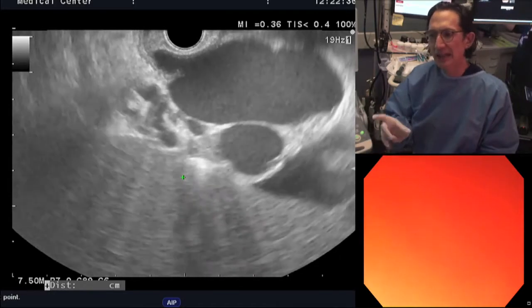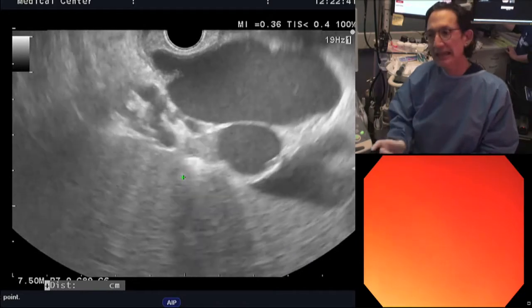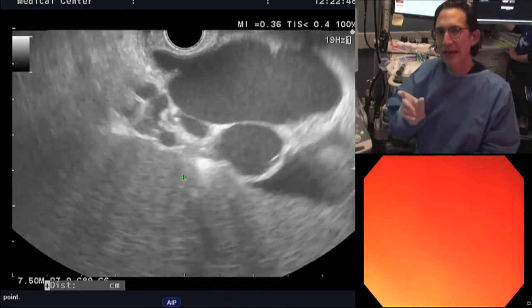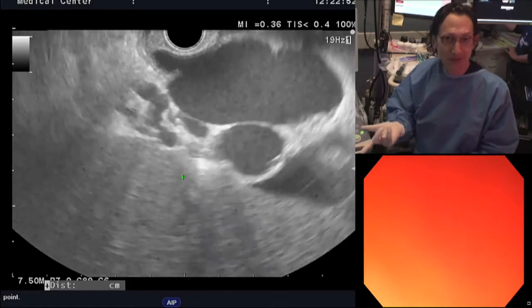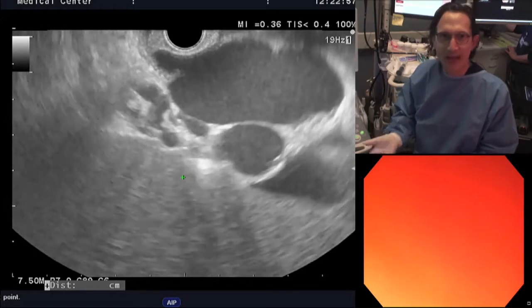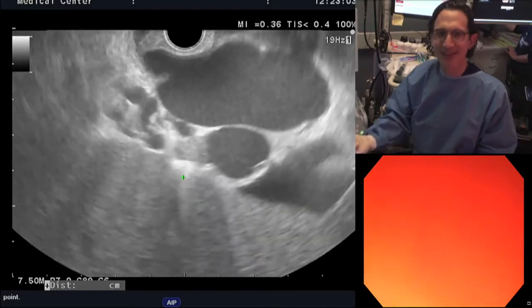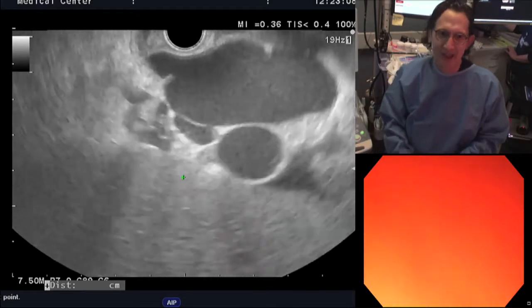And what the length determines is how many loops you get. So the length is how many loops form. The diameter is the diameter of the loop. If you have a varix that is 10 millimeters, you don't want to put in a 7 millimeter coil, right? Because it'll flow away. So you want to use a larger diameter. You customize the diameter to the size of the vessel that you're treating. Makes sense. All right, so we don't want to touch this here.